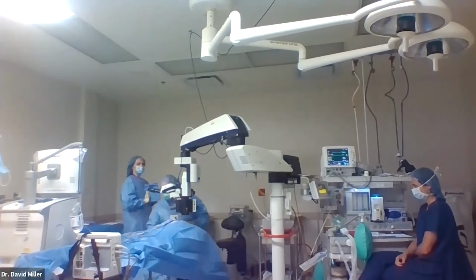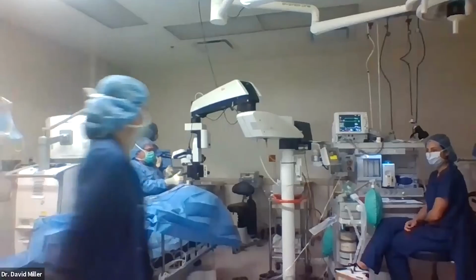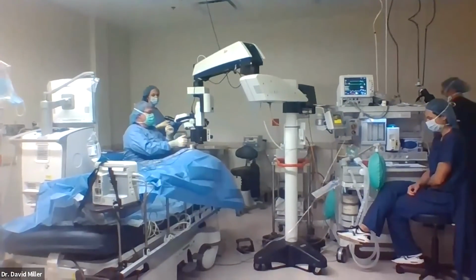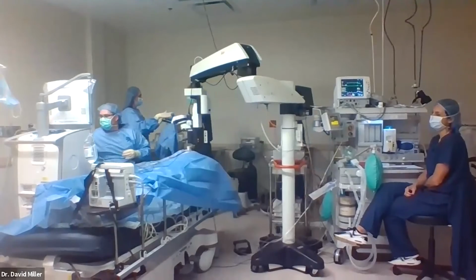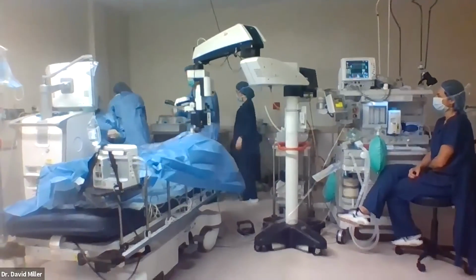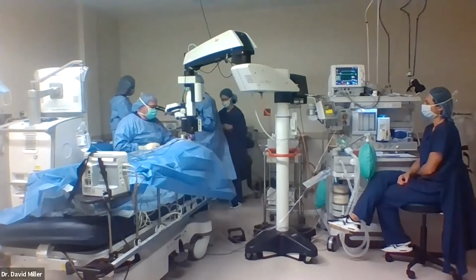This case is a little different, again, because of the recurrent nature of the detachment. Phakic, gas bubble in the eye. So right out of the gate, we're wondering whether there's going to be a cataract that's going to obscure our view because of the gas in the eye. The gas tends to make a cataract develop, or at least posterior feathering, which can make the view difficult. So sometimes we have to frag the lens out.